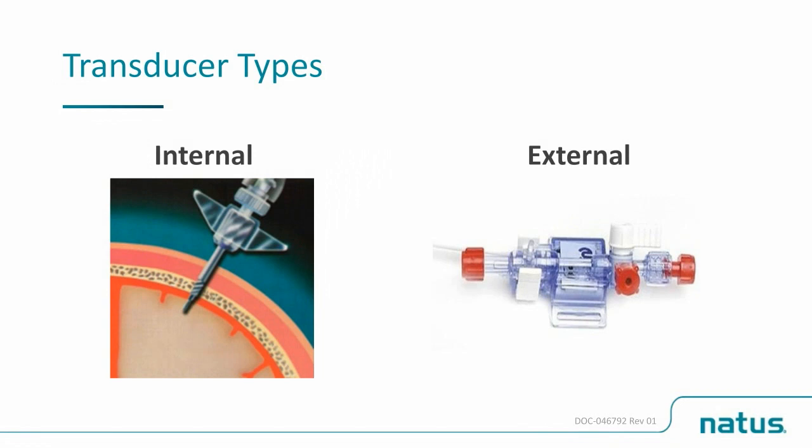If I had to guess, I would imagine that most nurses at the bedside taking care of neuromonitored patients probably haven't given a lot of thought to what type of transducer it is that they're using to get the ICP, intracranial pressure, or waveform information. Most of what we really want to know is how accurate and reliable the information we're receiving really is. So let's talk about that a little bit.